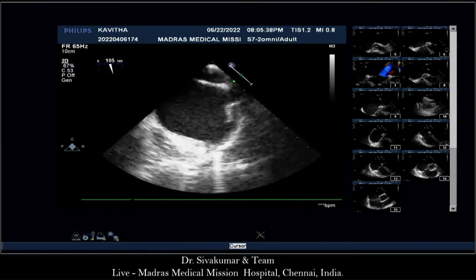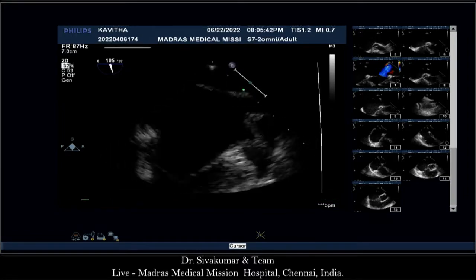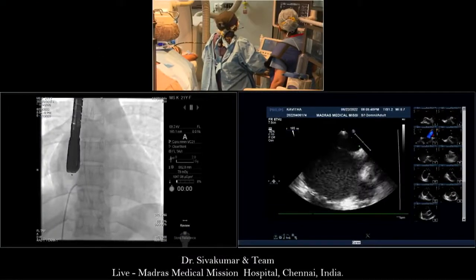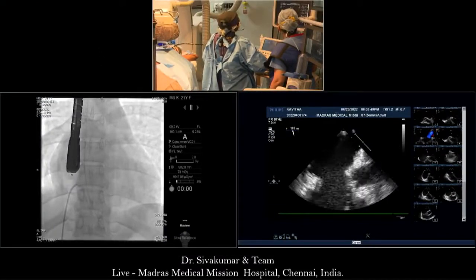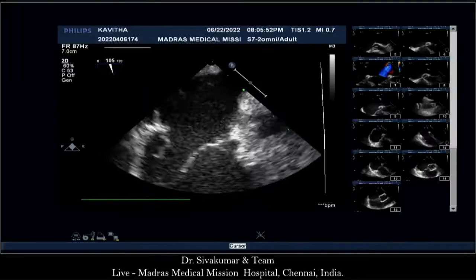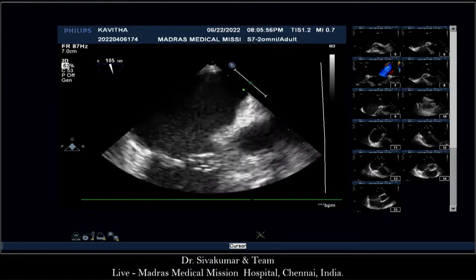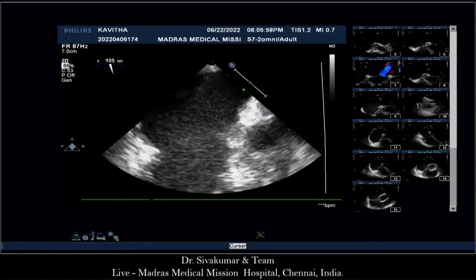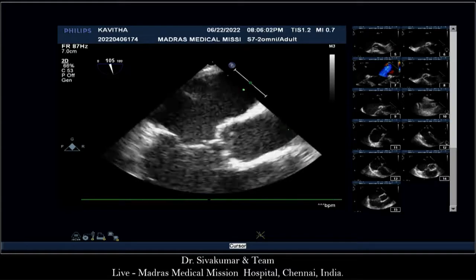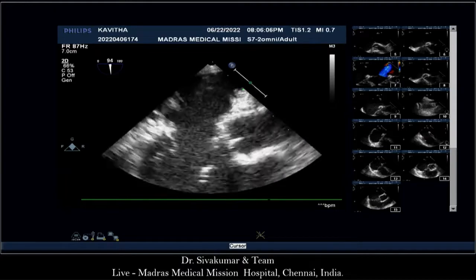I want the stiff wire again. So just on that aortic rim that you were measuring. You mean bicaval view? No, in the 60-degree view, it was where you measured with the aorta. It was slightly more into the left atrium where I might have measured it. Yeah. Good learning for the audience. Yes, there is some malalignment of the septum. There is some amount of atrial septal malalignment.